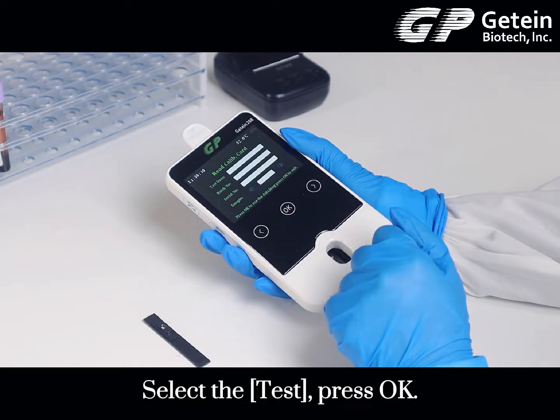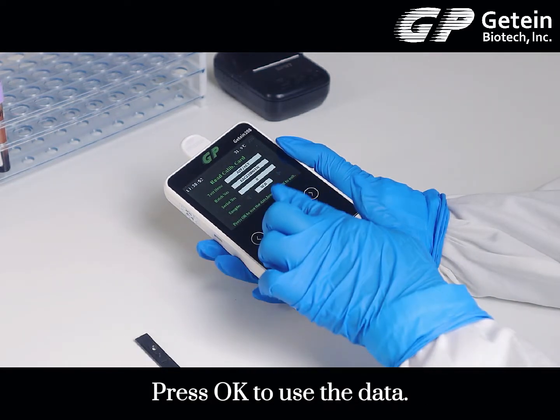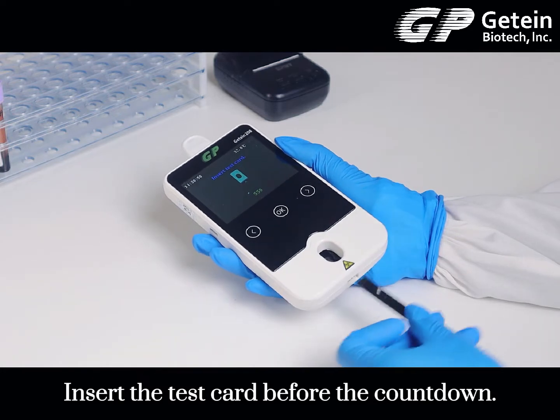Select the test and press OK. The analyzer will load to the read calibration card page. Press OK to use the data. Insert the test card before the countdown.